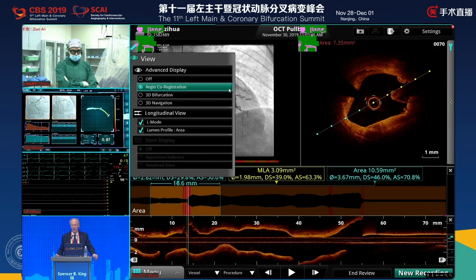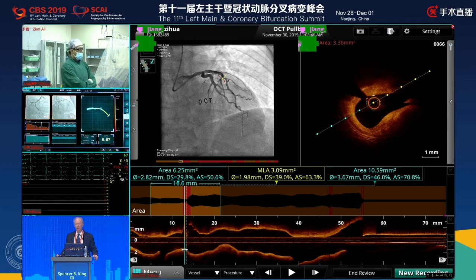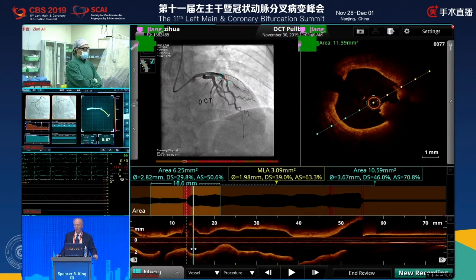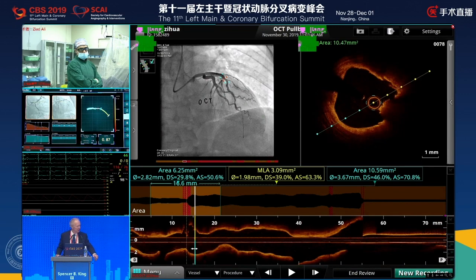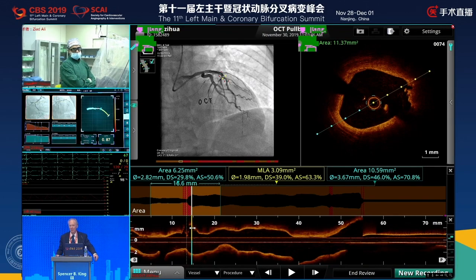We have a septal lesion that clearly has potential for producing ischemia. We've got a nodule in the LAD without any evidence that it's causing trouble. Is finding a calcified nodule an indication for anything other than antithrombotic therapy? 8 hours of chest pain without troponin leak is not an ischemic event, it's angina or non-cardiac.